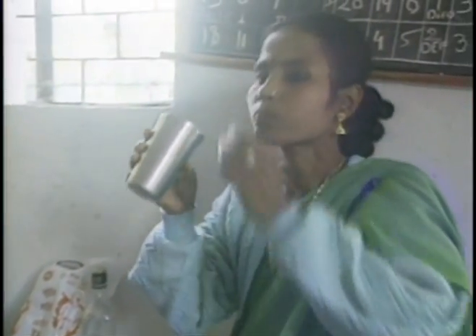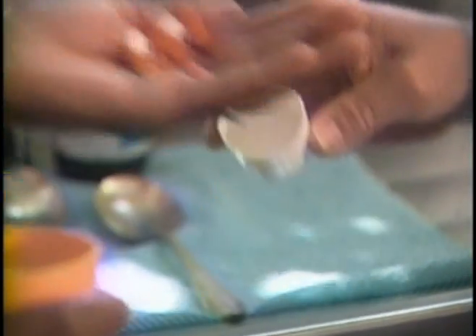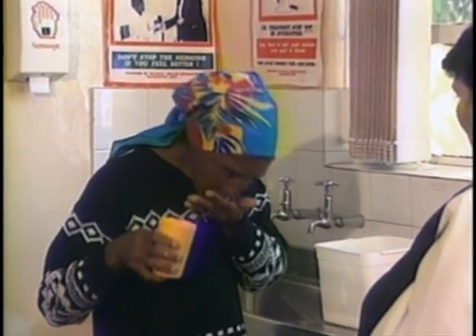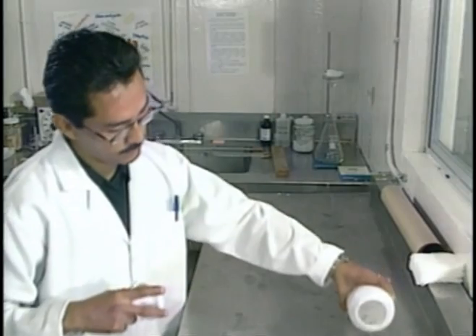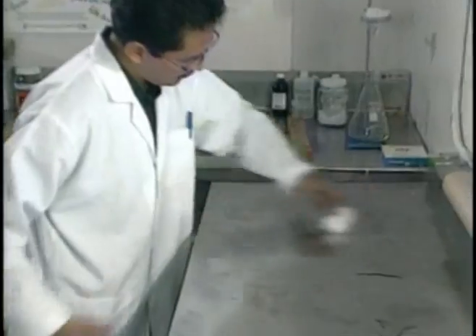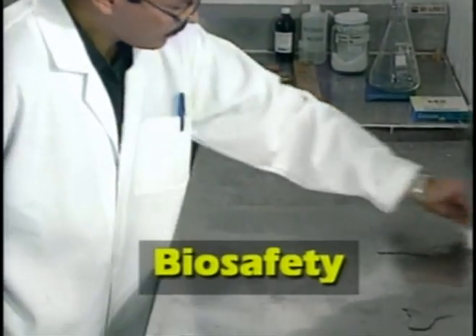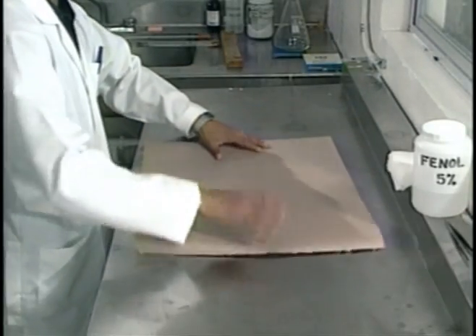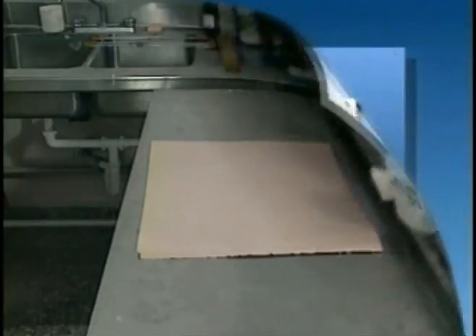Identifying these cases can lead to treatment and cure while interrupting the flow of TB transmission. This procedure can also assess response to drug therapy and monitor cure rates after treatment. There are many facets to the process of smear microscopy. First, let's discuss biosafety. Working with TB requires care and special precautions.